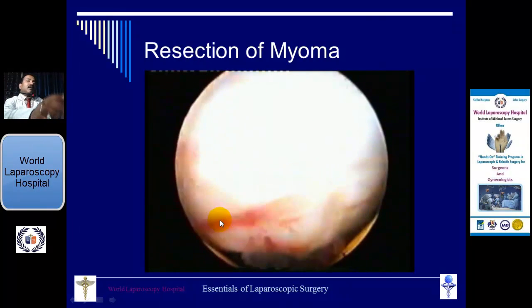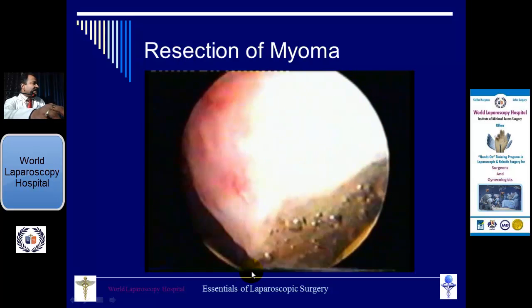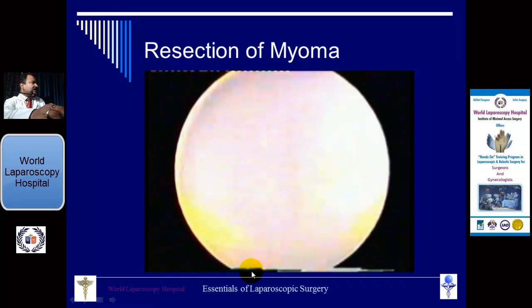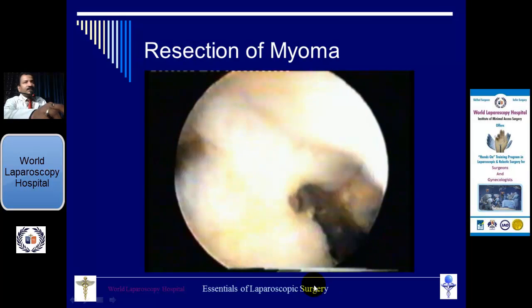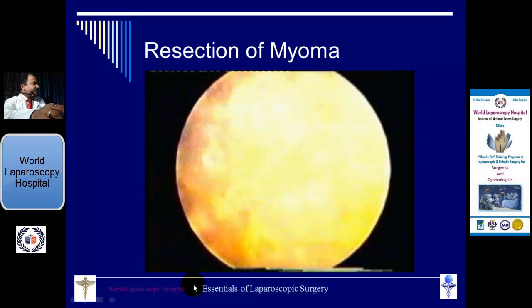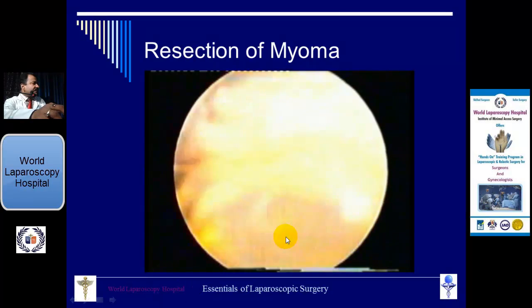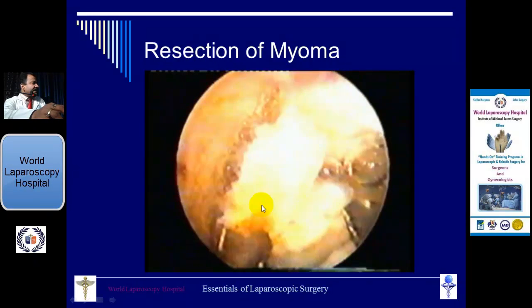You go and come towards you, and here it is cutting with the electrode. Again you go, again it cuts. And then you will see the darker. Darker means deeper. Brighter means nearer. So you must see that this is darker and this is brighter. That way texture gradient helps.